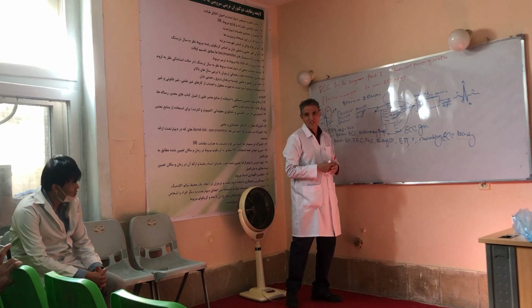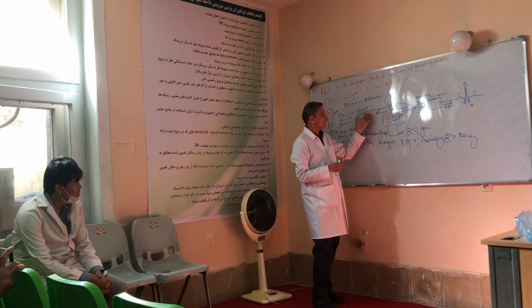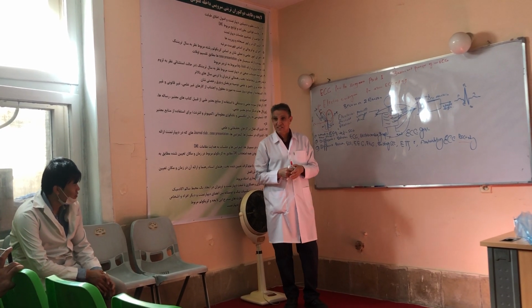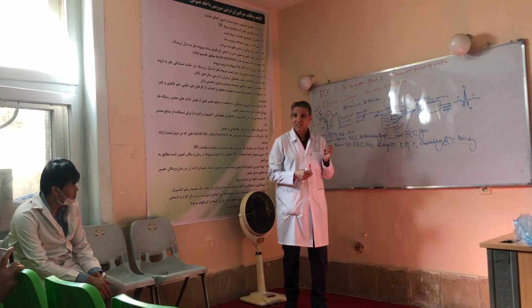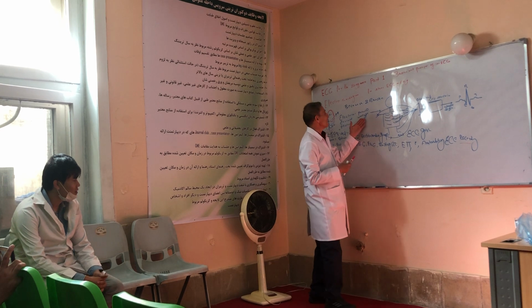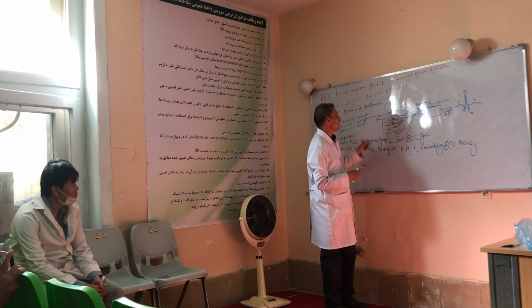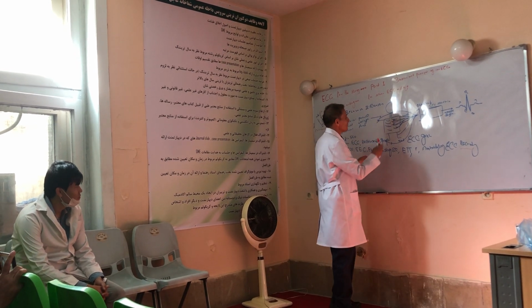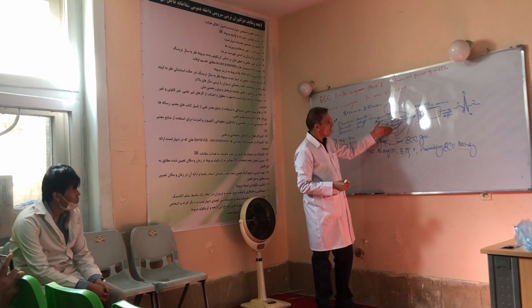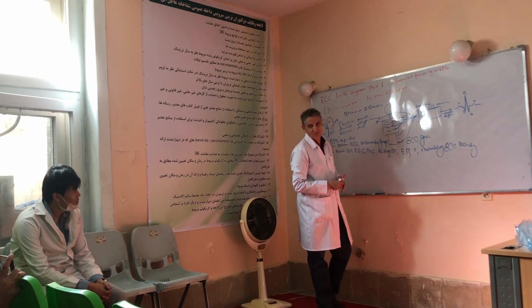When we are talking about the vector, you should think about the electrical force. Since this is physics, they are presented by a vector. When you hear the name of the vector in ECG, immediately you should think about the electrical potential. Now this electrical force, which is produced within the heart, moves from inside of the heart to the outer part of the heart, I mean the skin surface.